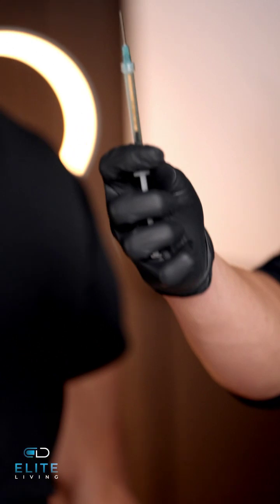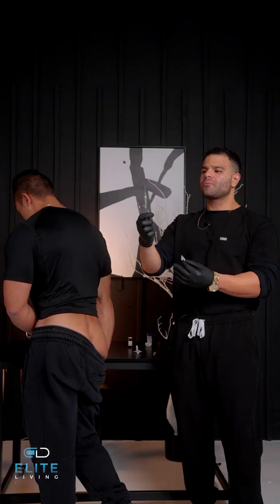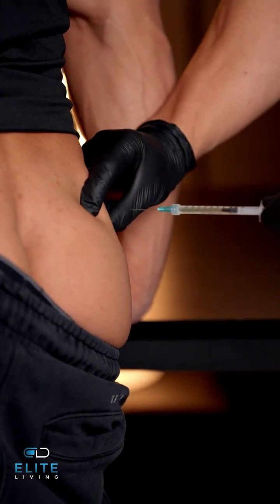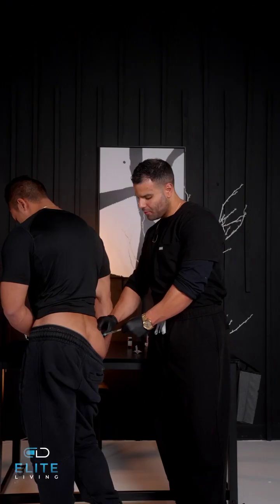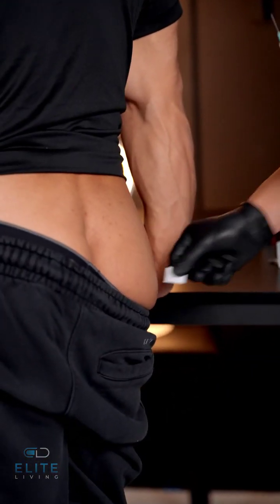First, we're just going to want to push the medication up here this way, just to get a little bit up so that you see just a little bit flowing. You're going to make the skin clean. And inject. Always clean the site once again. And you are all done.